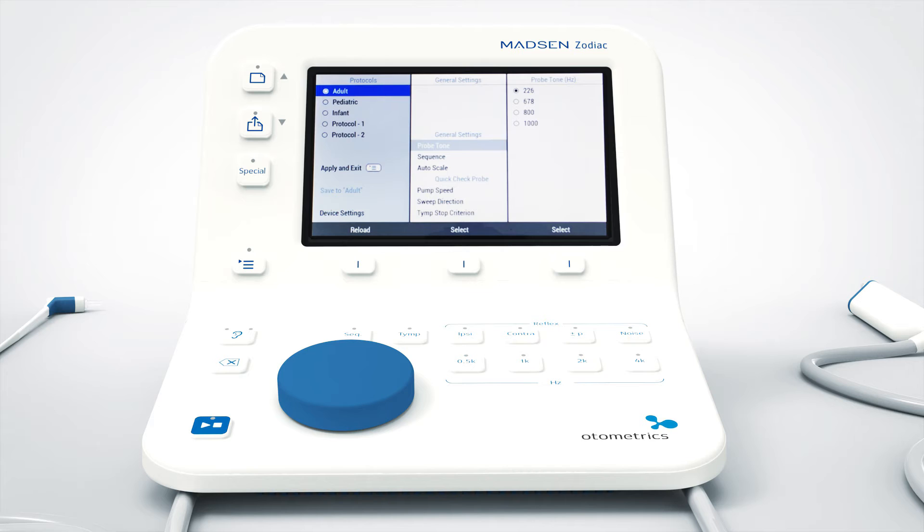The menu is composed of three columns. The first column shows available protocols, for example adult. The second column shows the settings in your protocol, for instance pump speed, and the third column shows the choices available for each setting, such as the preferred speed of your pump.